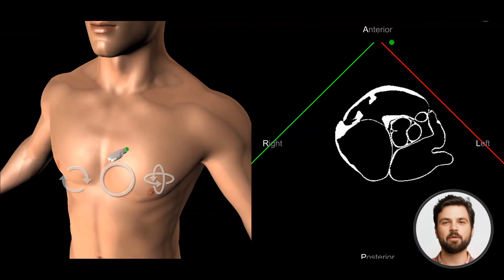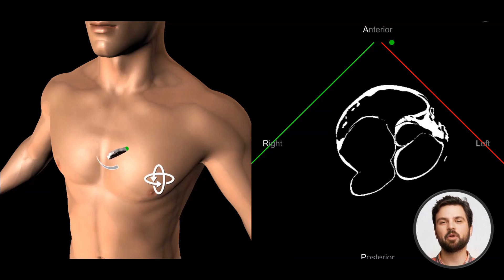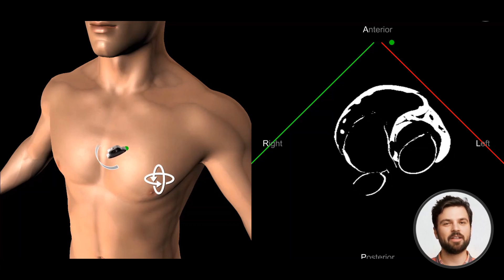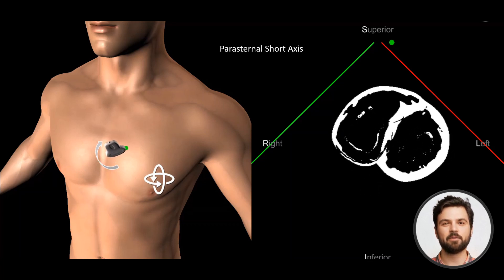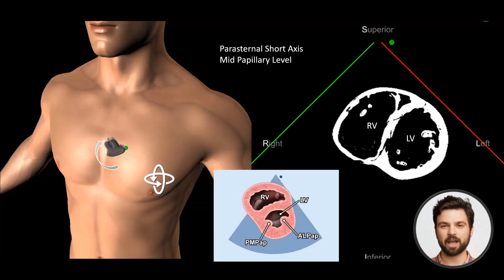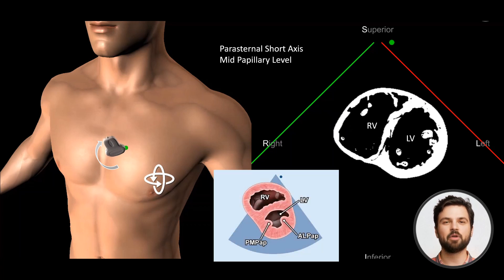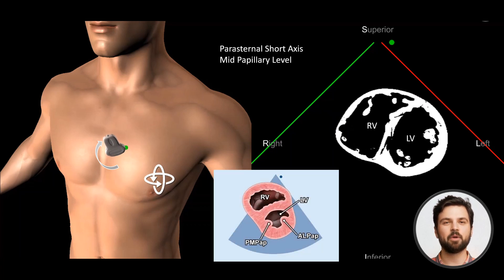We now need to get to the mid-papillary short axis view. This is done by fanning the transducer towards the apex of the left ventricle. The ultrasound beam will now cut the left ventricle through the papillary muscles.